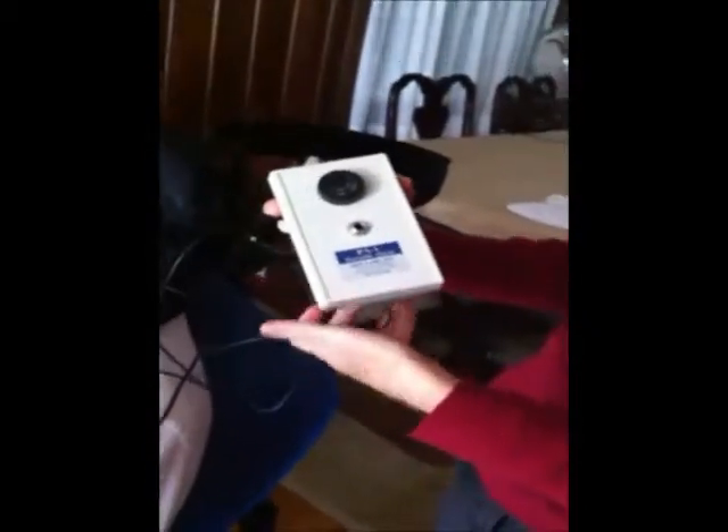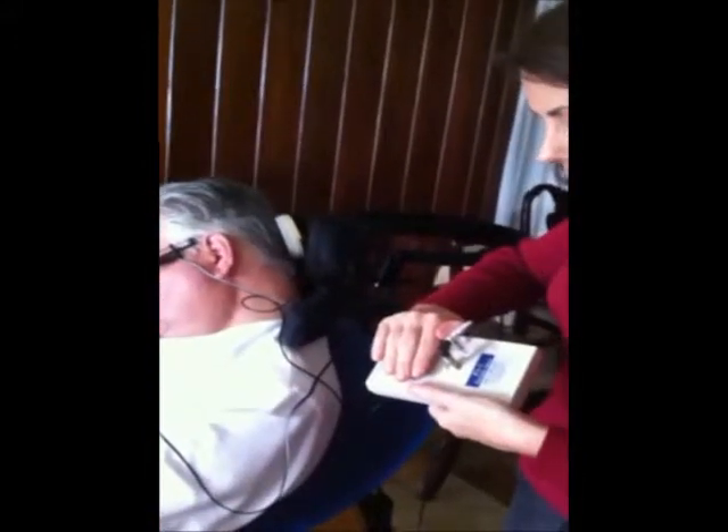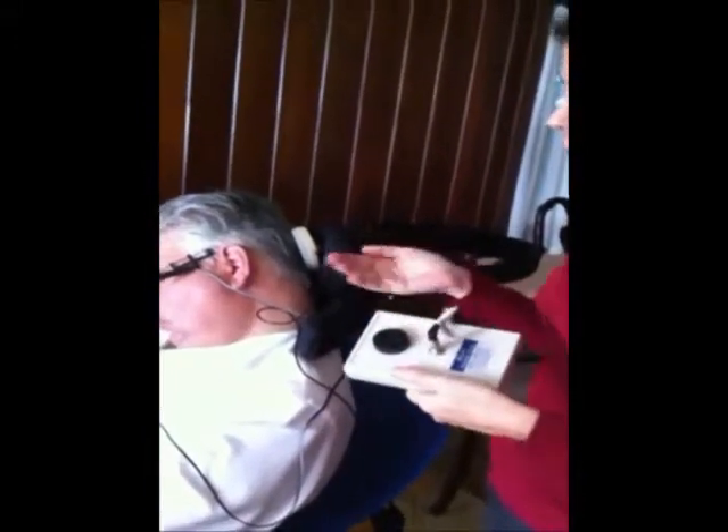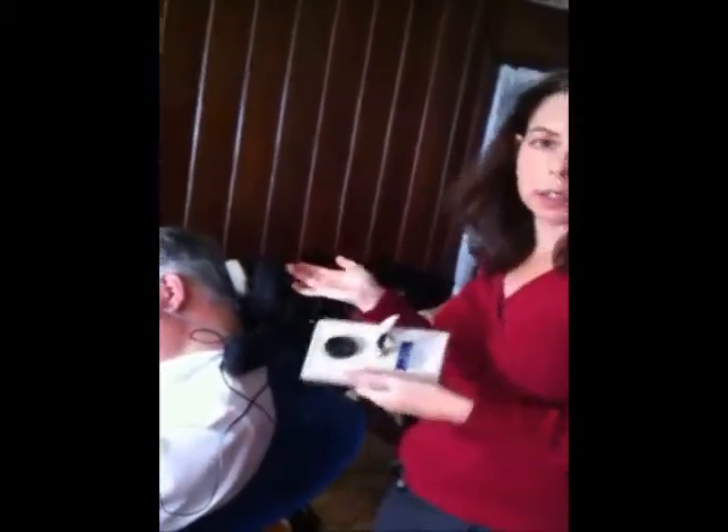This is a Medlabs portable alarm. I like these because they're reliable. They're not wireless, but they're very reliable. Can you hit that switch? Perfect. What we don't want is for him to always be hitting it by accident, or for it to be a difficult switch for him to reach. I think we've got a perfect setup while he's in his wheelchair.